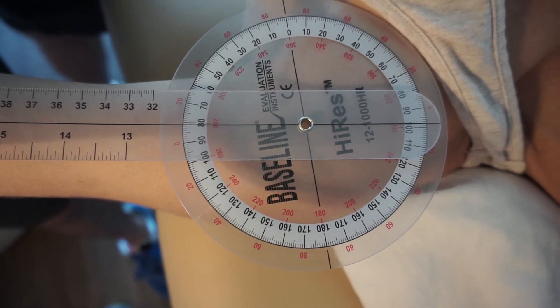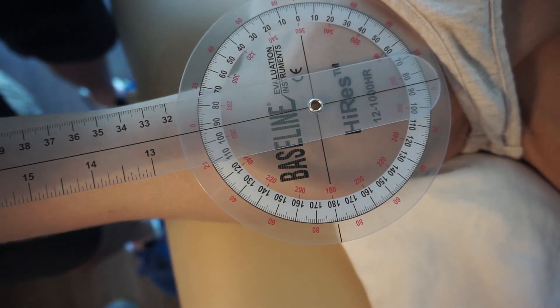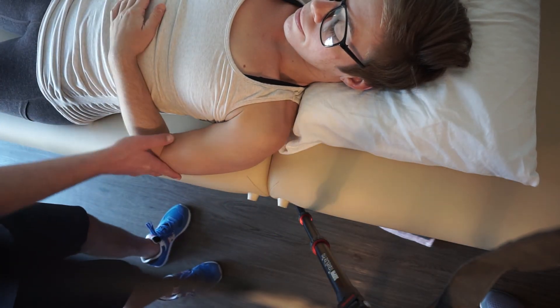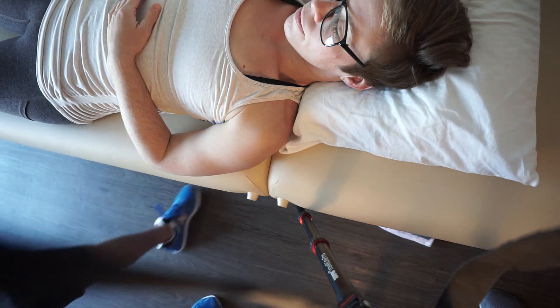I'm going to apply some pressure — it starts to get firm right there — giving us 95 degrees of passive shoulder abduction. That indicates it will need to work on some inferior capsule stretching. And that's your goniometric measurements for shoulder abduction.